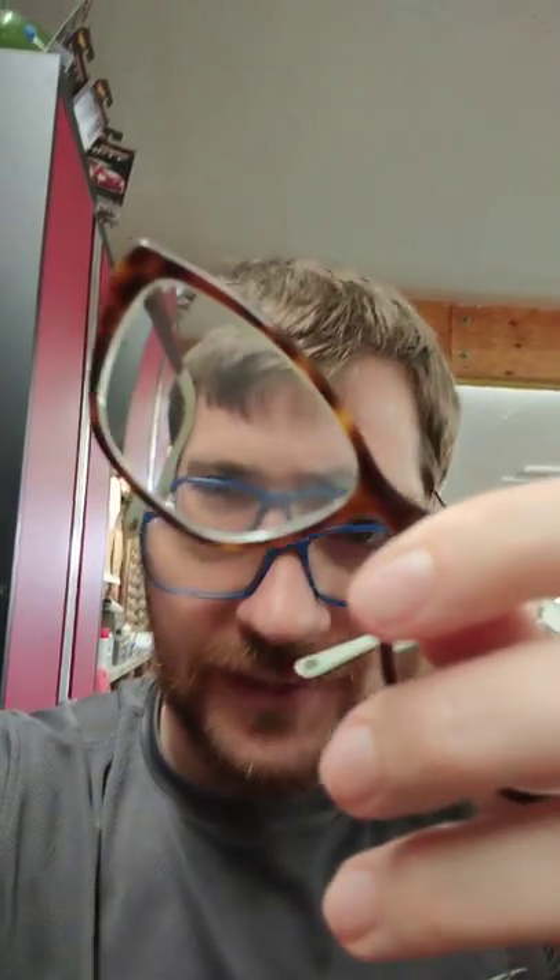The other type is the one we all know — you scratched your lens with the screwdriver when you were tightening the temple. It happens. You deal with glasses every day, it's going to happen. So if you're at home trying to fix your own glasses and you did that, in that case you've got typically more of a gouge in the lens.